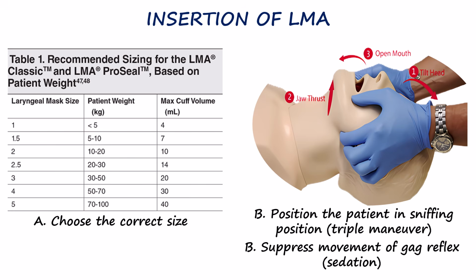We have discussed positioning in our previous video. At the same time, we must ensure that the patient doesn't awaken during insertion. If necessary, sedation may be used to prevent gagging or movement.